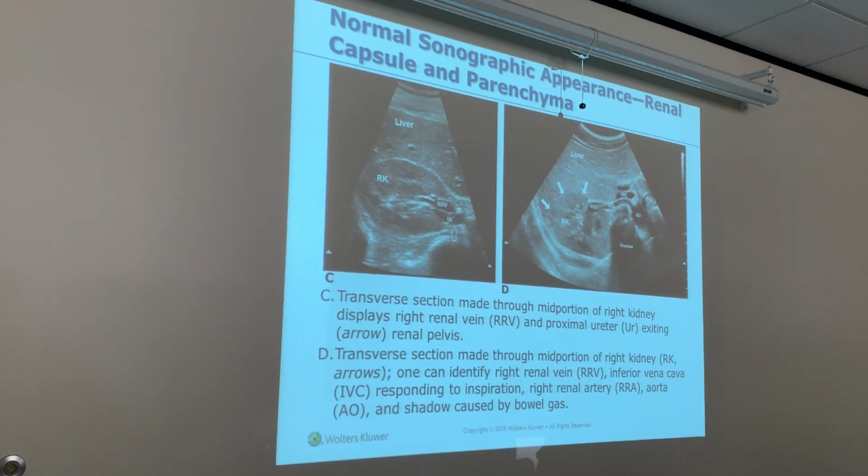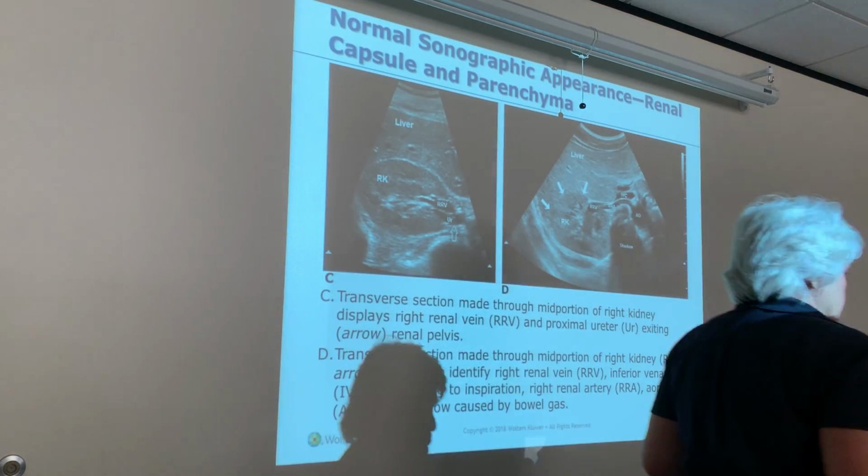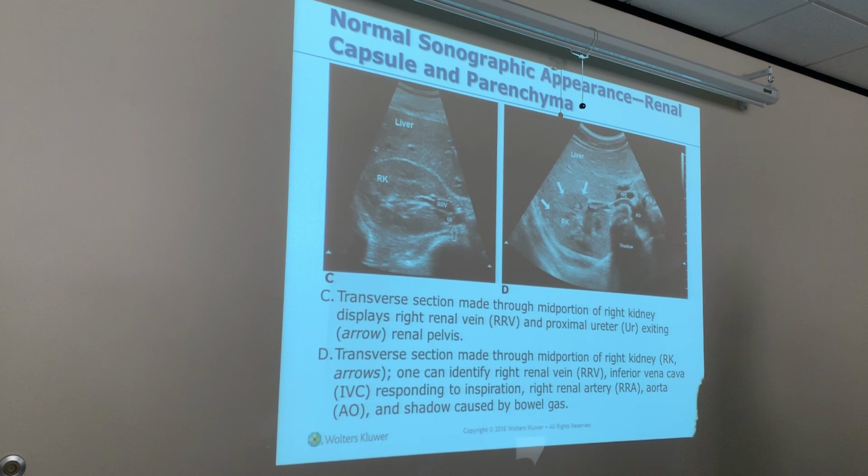Okay, so I have a story on that. I had a sonographer come to me. He goes, Georgette, could you come and look at this? I think this lady has a tumor. I said, okay, so I went and I looked. I said, I don't see it. You show me, and then I'll try to duplicate it. He was pressing so hard on her that he was looking at her spinal cord inside the spine. You don't have to push that hard.